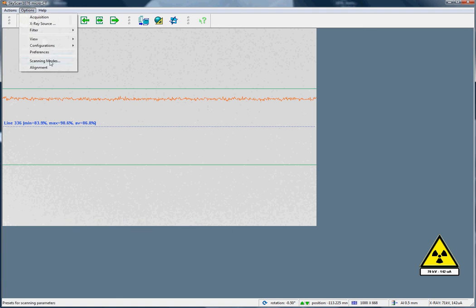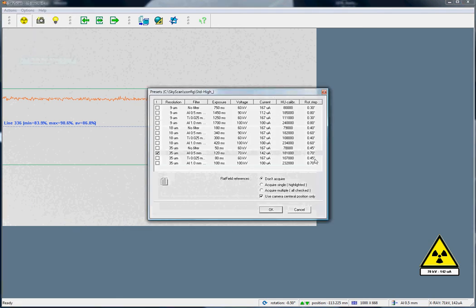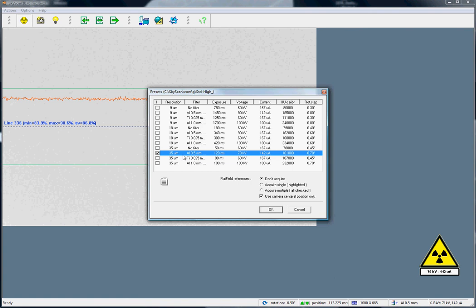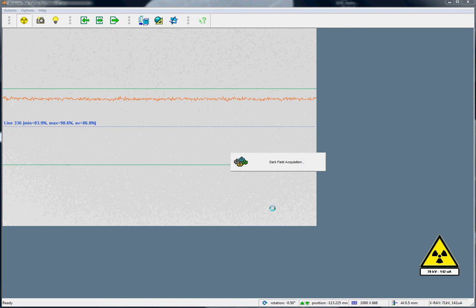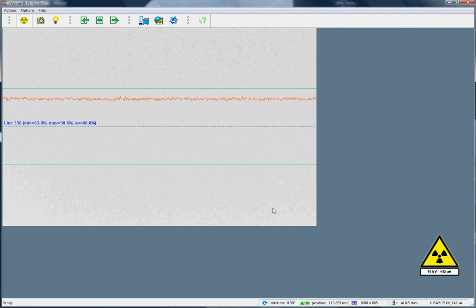We go to Options, Scanning Modes, and with this current mode selected, we choose the option Acquire Single. If we are scanning mouse, for example, and we only need the central image, and we do not employ the left-right offset imaging, then we can use the camera central position only. In that case, we click OK. The flat field correction is taken.